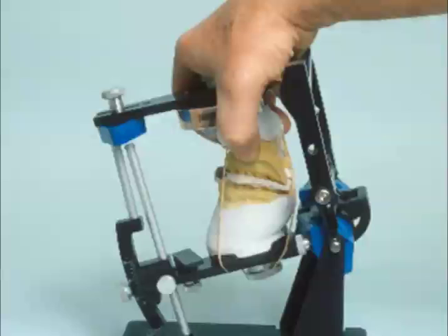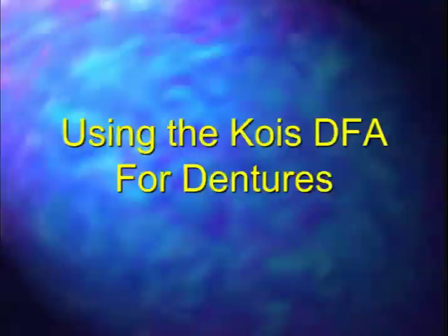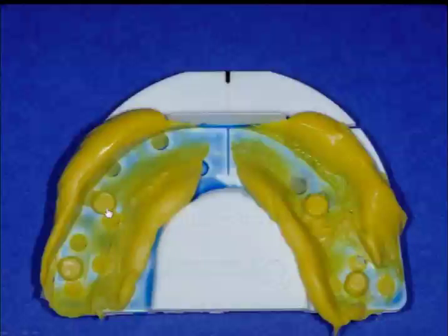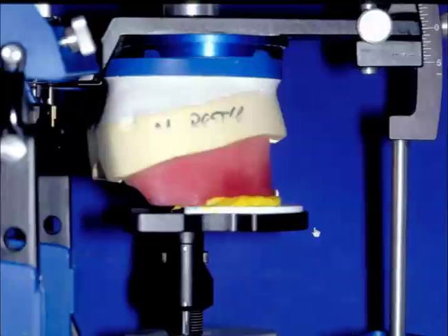Dr. Kois also uses his Dento Facial Analyzer for dentures. What he'll do is set up the incisal edge where he wants it vertically in the face as well as anterior-posteriorly for lip support. Then he'll take the back of his mouth mirror and make a couple orientation dimples in the occlusal surface of the bite rim. Then he'll take a PVS material and put it on the Kois index tray and take a face bow registration of the bite rim. Here we can see the little orientation dimples in the bite registration material so that the bite rim will reorientate correctly onto the Kois index tray when we come to the platform to mount the cast.